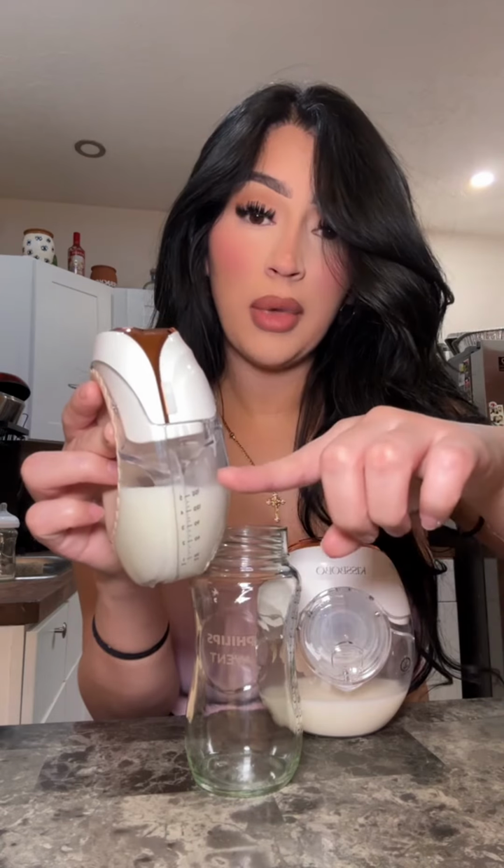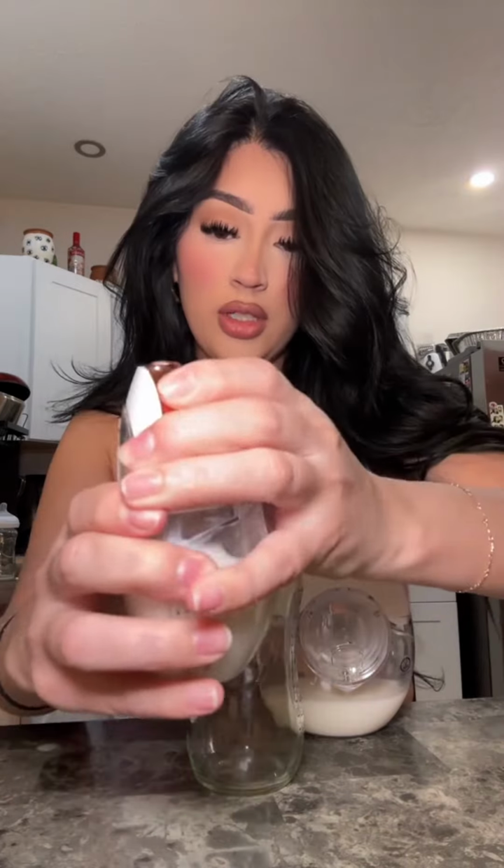I pumped for about 25 minutes. It says the amount of ounces on the side. Just take off the top right here. I love how they stand like that.